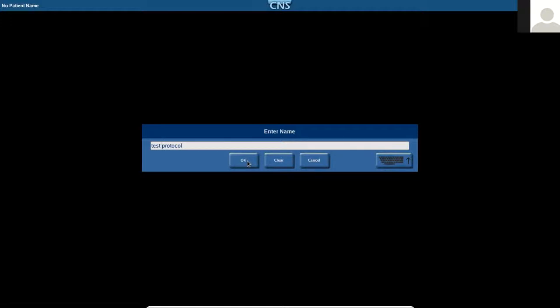So maybe for different research protocols, you might be dueling, I was going to say dueling pianos, but dueling EEG devices, right? Or dueling pieces of equipment that you're swapping back and forth. And so having those named differently for that protocol, either by physician name, PI name, or even device name, I think can be really helpful.